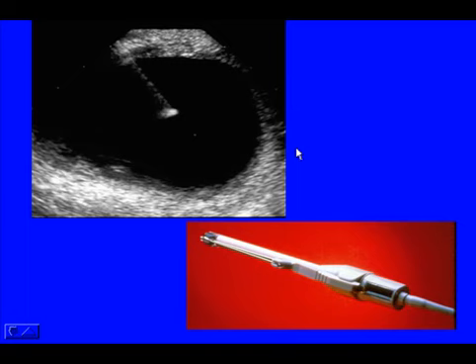In premenopausal women who present with large ovarian cysts, greater than 5 centimeters, we perform transvaginal guided cyst aspiration. We use a transvaginal probe with a guide and insert a 20 gauge, 20 centimeter needle through the vaginal vault into the cyst, aspirating the fluid.